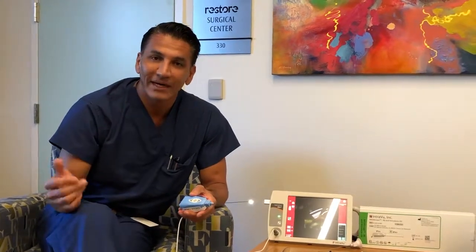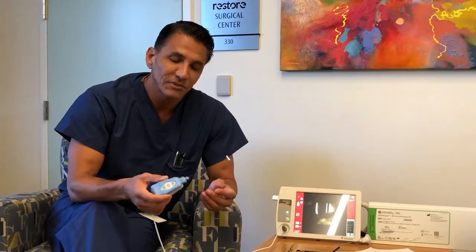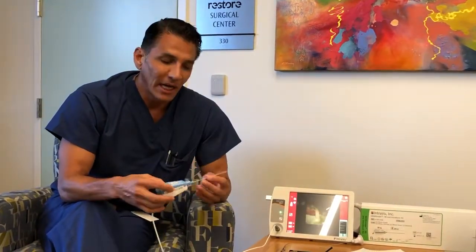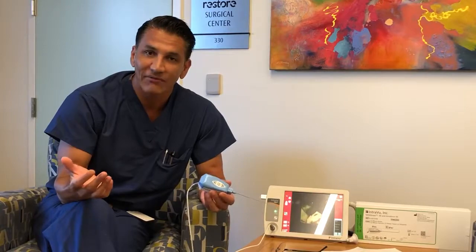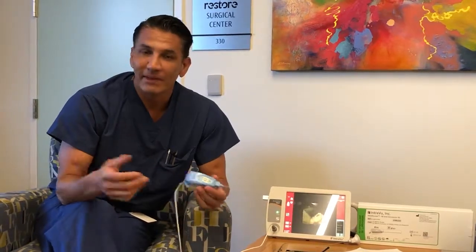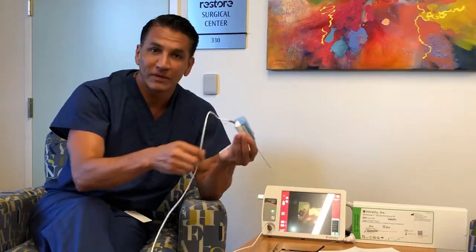So those patients can benefit from this because before they're cleared to do sports, or before you tell them that you need another MRI, before you scare them with the possibility of more surgery, you can tell them that you have an instrument that's essentially just a big needle with a little camera at the tip, and that you can put it into their knee with a little bit of local anesthesia. I usually use about 30 cc's of local anesthesia. I don't need any staff, except maybe my MA, just to hold the cable so it doesn't move around.